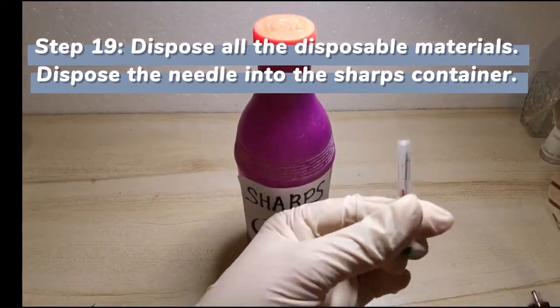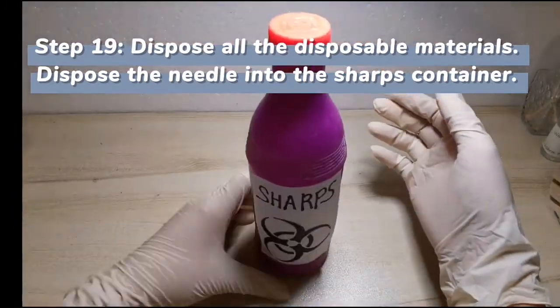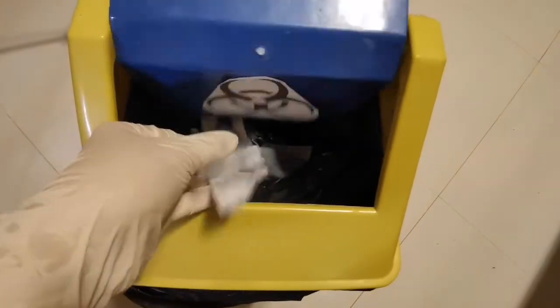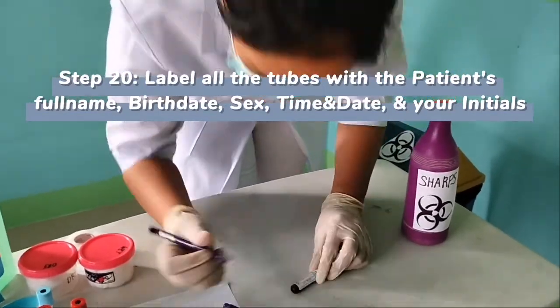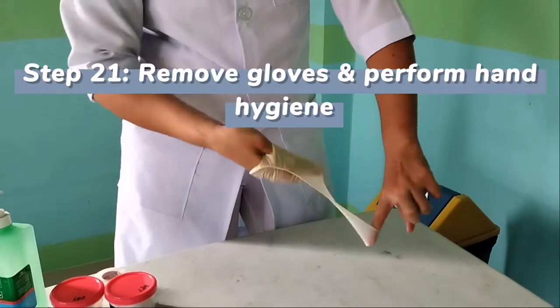Dispose of needles into the sharps container. Disposable materials should be disposed of properly. Label the tubes completely.